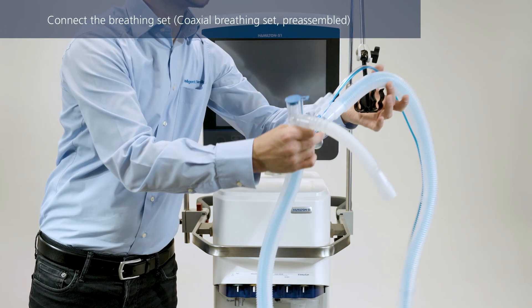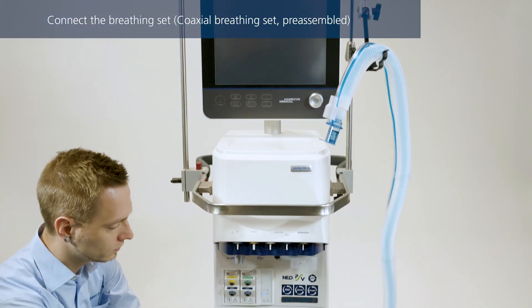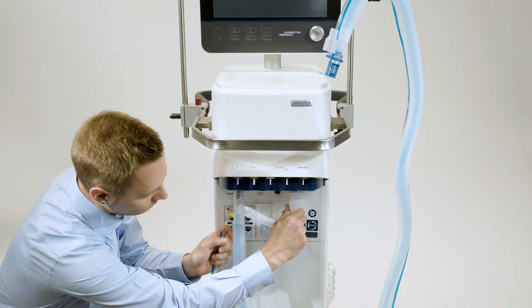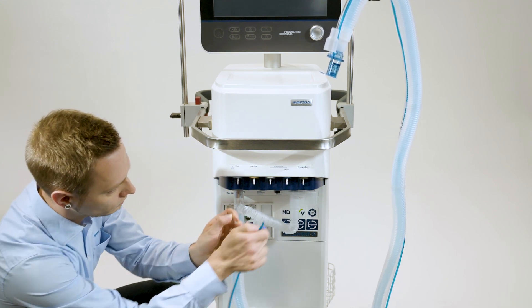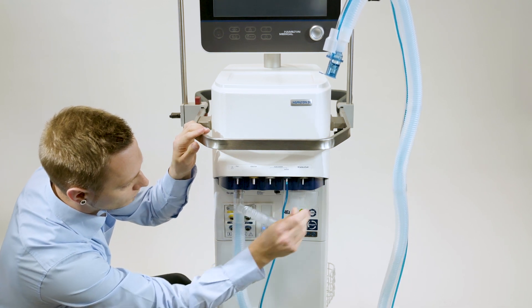To connect the coaxial breathing circuit, first attach the main tube to the inspiratory port and then connect the expandable expiratory tube to the expiratory valve. Finally, attach the blue and clear tubes to the flow sensor connection ports on the ventilator.